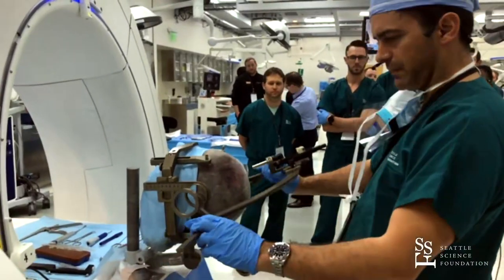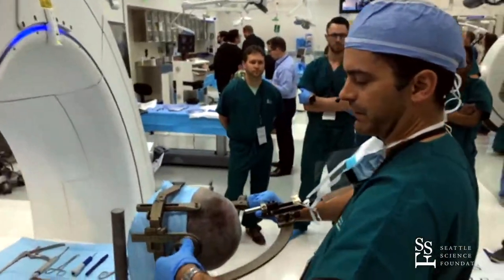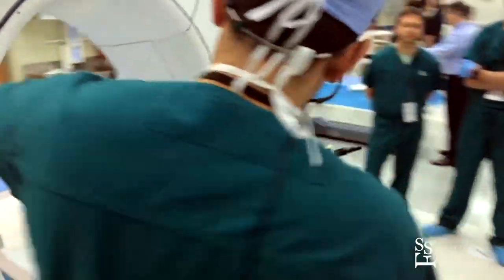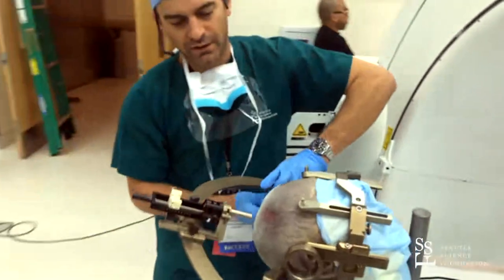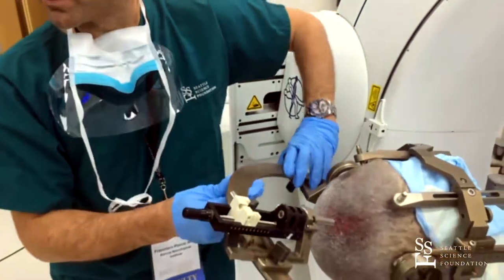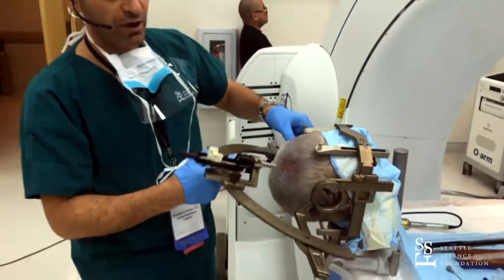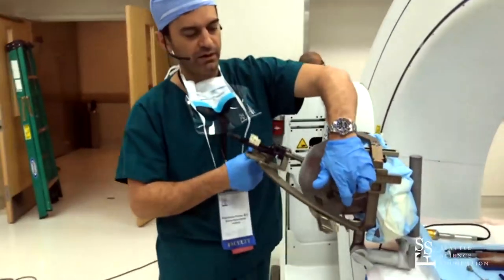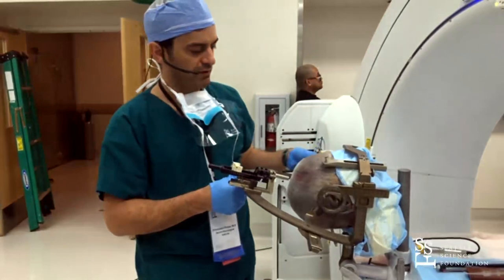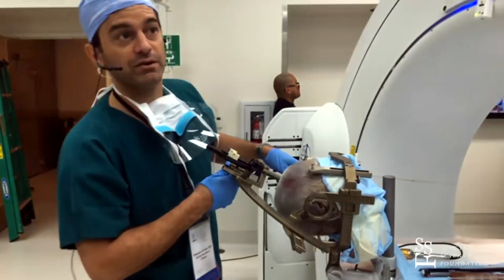This tool is all about having twenty separate pieces fit together perfectly so that you can maximize the accuracy of the system. So it's engaged — lock it, secure it. What this frame is doing right now — that's a little bit loose. So as this goes up and down, it continues to target the target we selected on an MRI. Right between these circles, this is pointing right at it no matter what our arc or ring is set at. So our ring is going to be 51.3.